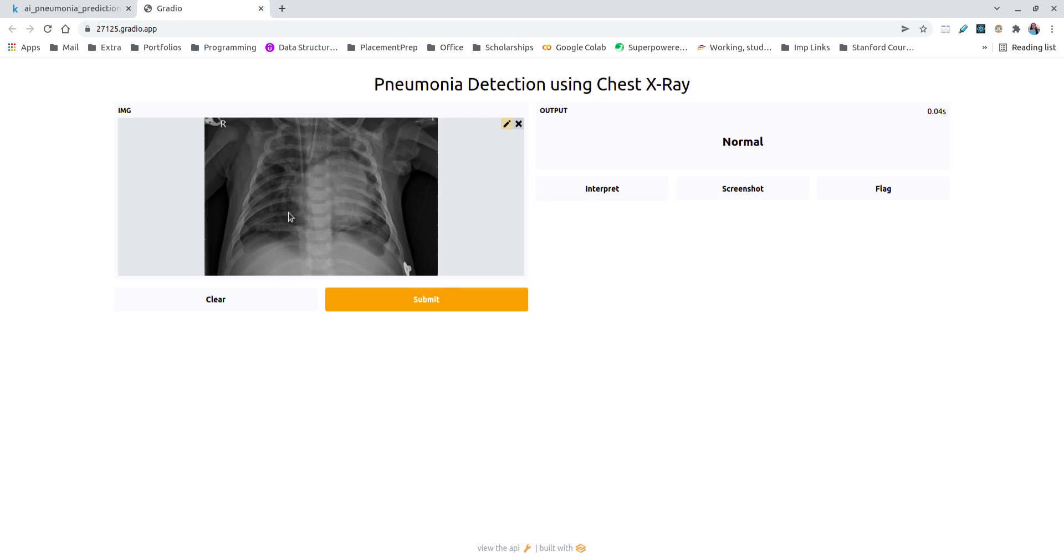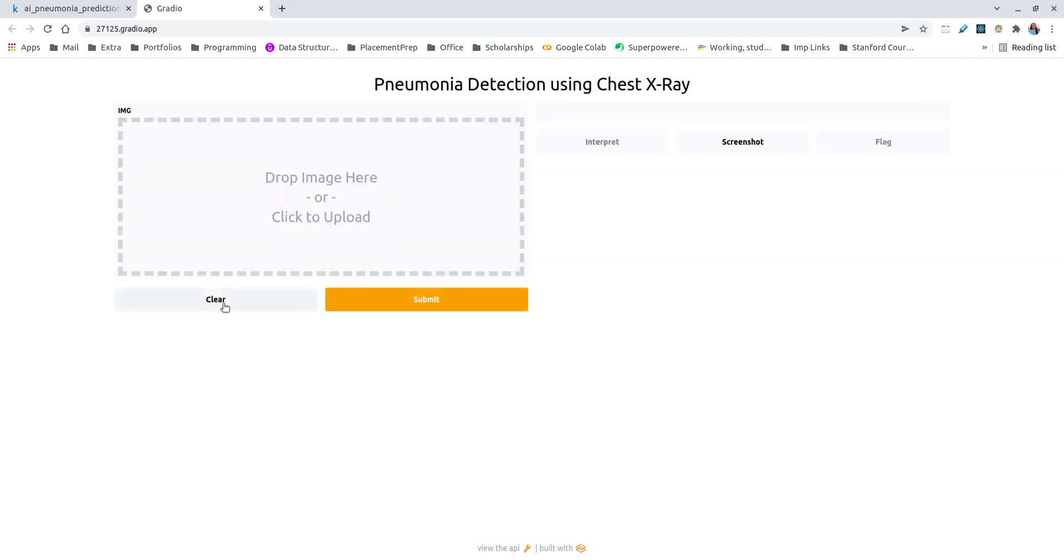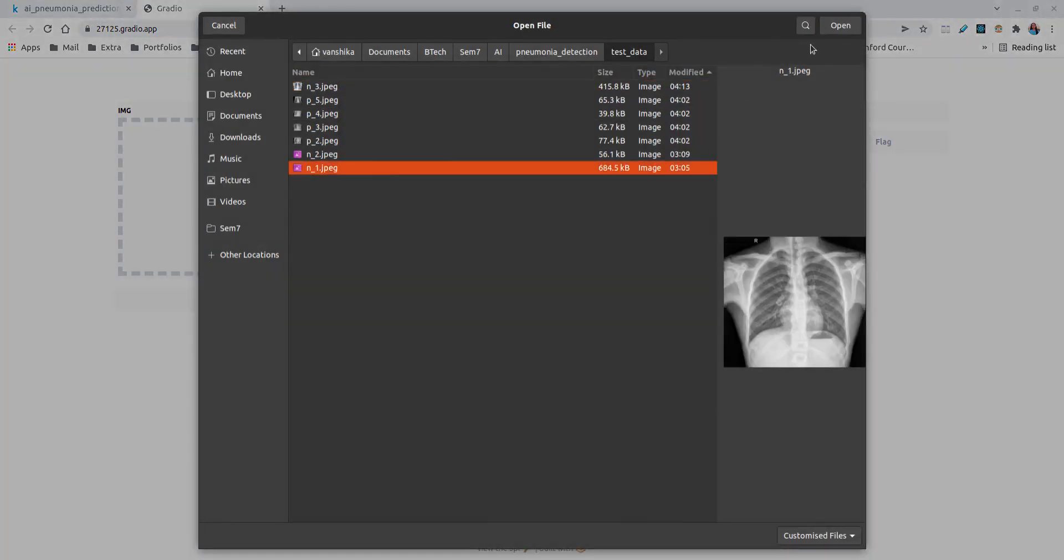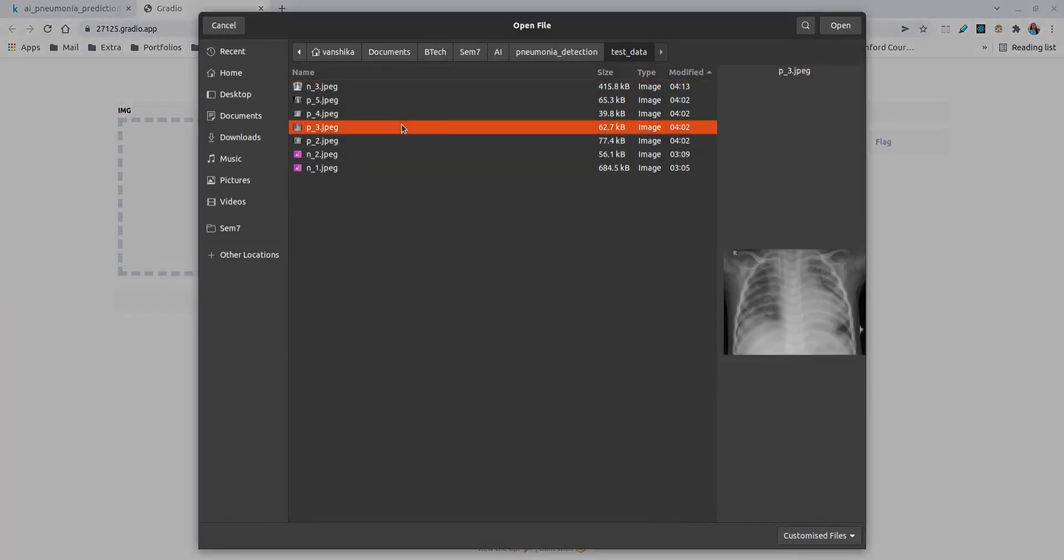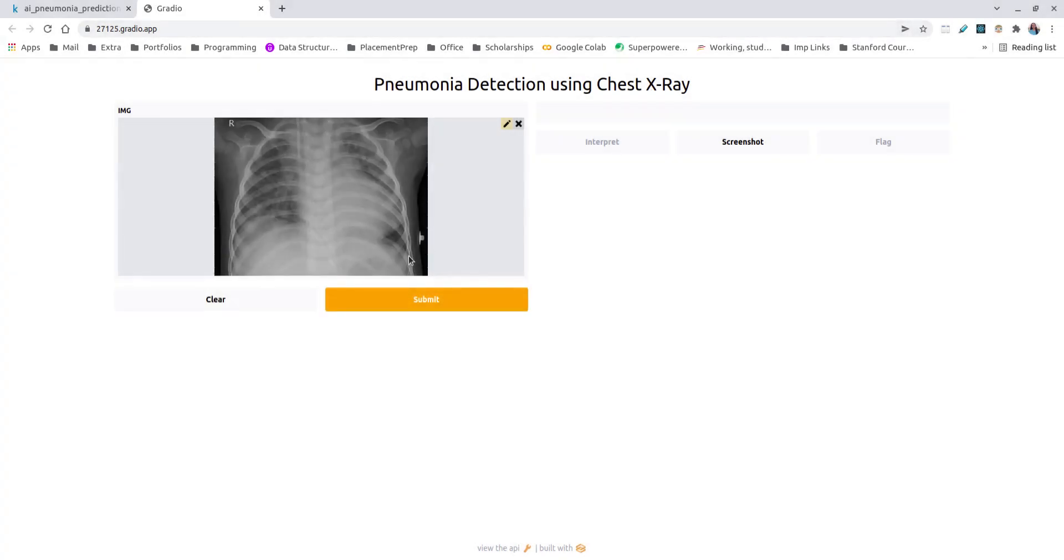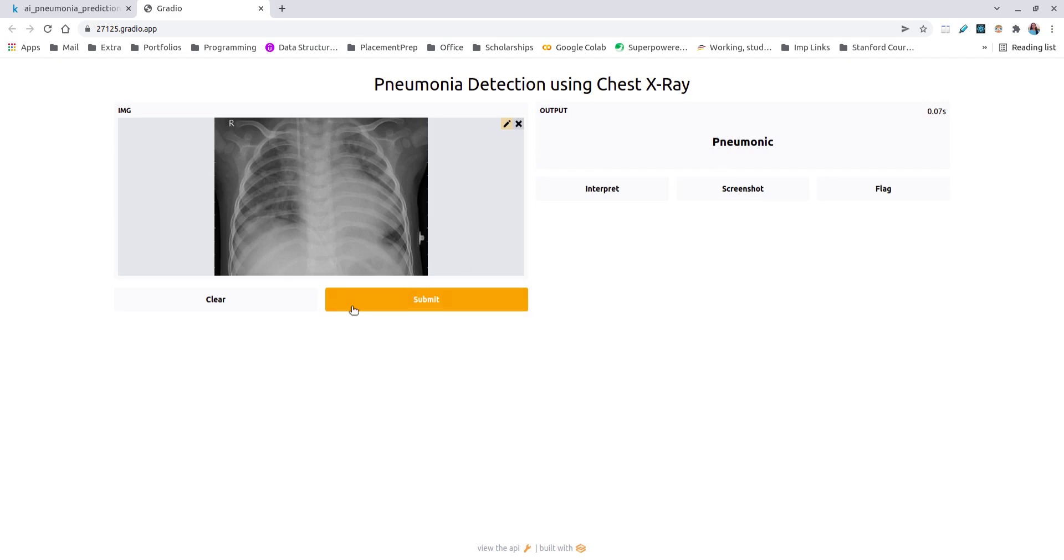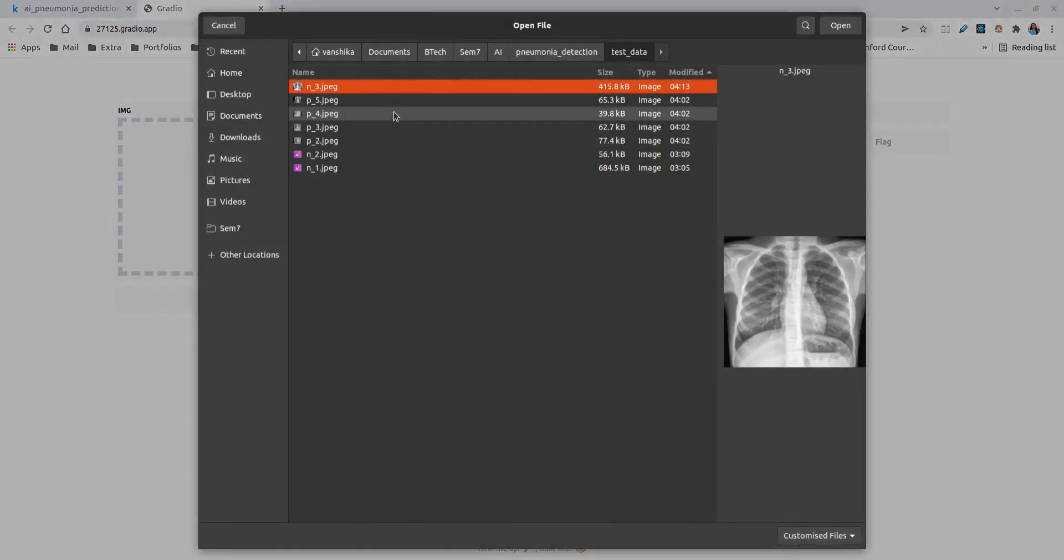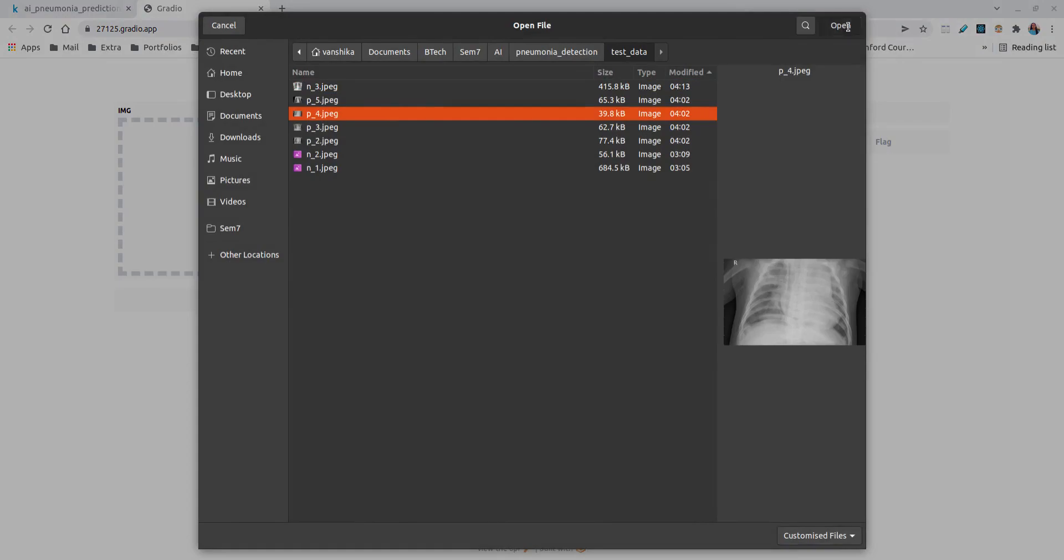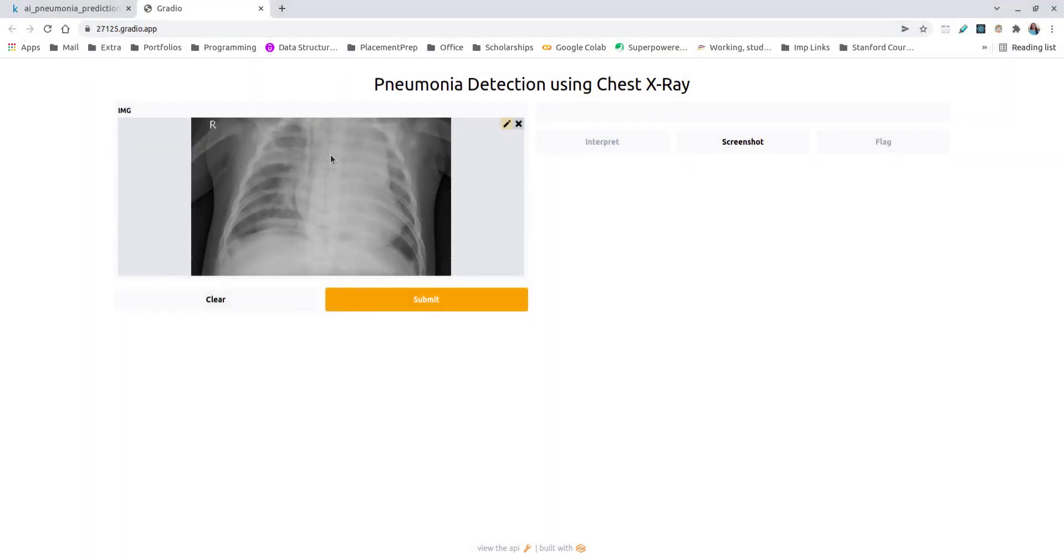This particular very clear image wherein we cannot see any obfuscation or excess things in this particular region of chest is characterized as normal, meaning this person with this X-ray does not have pneumonia. This X-ray also looks very perfect, very clear, and it's also categorized as normal. As compared to the previous two images, this particular image looks a little fuzzy around the lower regions of the X-ray and it is characterized as pneumonic. This one looks even more fuzzier than the previous two to three inputs and is characterized as pneumonic.